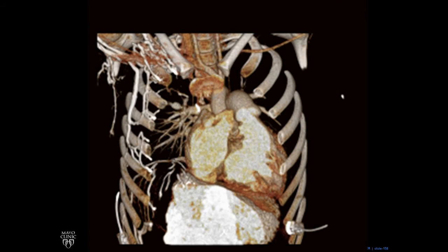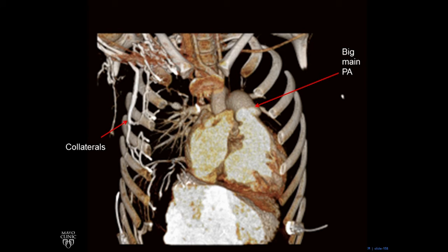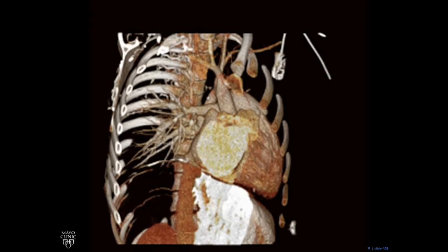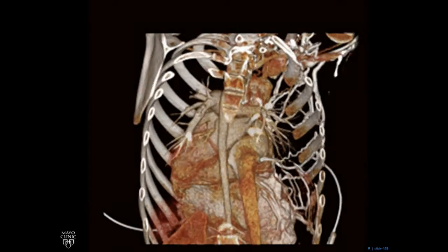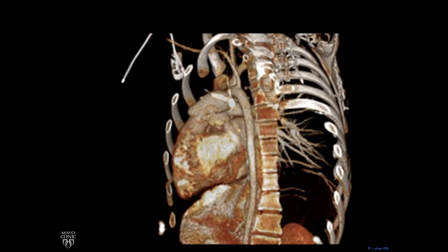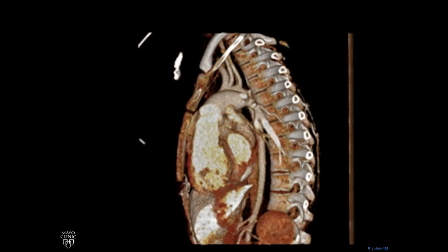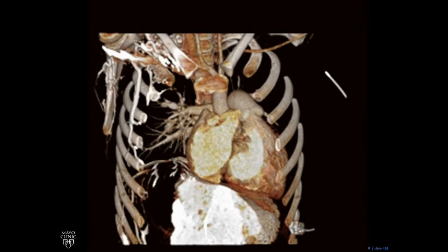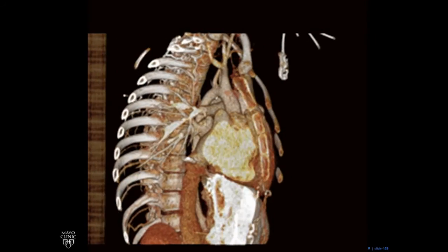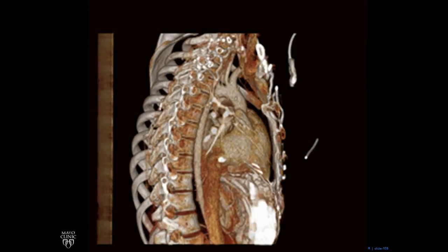Going to the CT scan — there are a lot of collateral vessels on the right side, from a superior vena cava venous obstruction. You can see the liver is super white; contrast is being shunted there. The main pulmonary artery is big — it's what makes that contour. Those are collaterals from the venous obstruction. We rotate around and see the right pulmonary artery branches, which are peripherally narrowed. Now we see the left pulmonary artery branches — they're not as narrowed, but the pulmonary veins are narrowed on this side, so there's not perfusion to the left lung. You can see how large that left pulmonary artery is. Coming back to the frontal view, you can see how that bump is the main and left pulmonary artery, causing that cardiac silhouette.